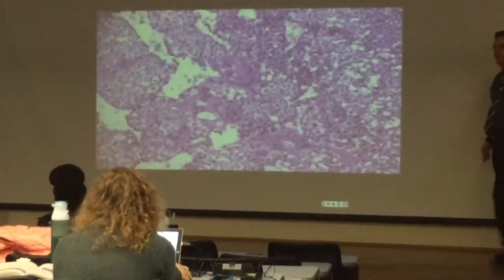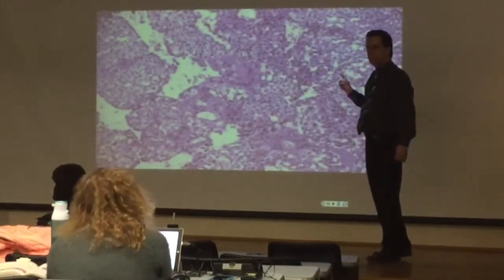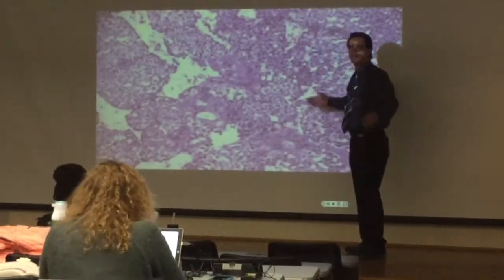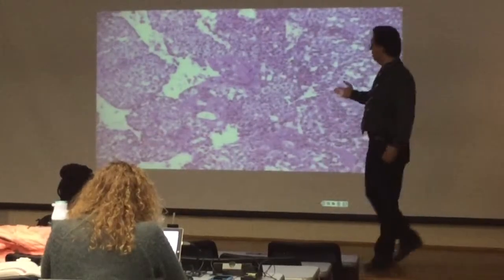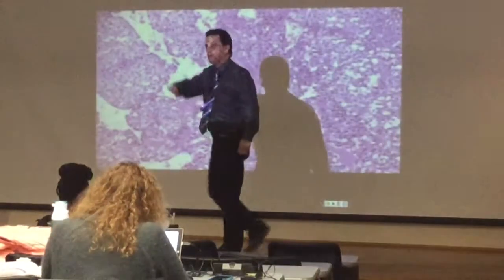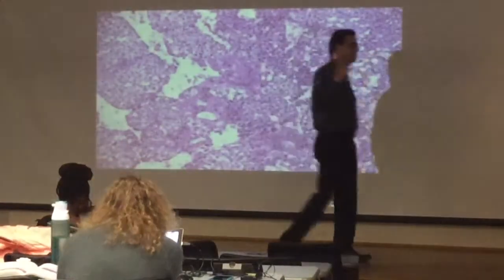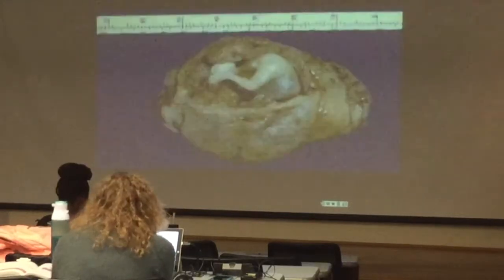This is choriocarcinoma. The difference between choriocarcinoma and molar pregnancy is this: in choriocarcinoma, you should not see any chorionic villi. You just see syncytiotrophoblasts and cytotrophoblasts. This is a malignant tumor of the cytotrophoblast and syncytiotrophoblast. So remember the way choriocarcinoma presents: if beta HCG after the D&C for molar pregnancy doesn't come down or goes up, it's choriocarcinoma. They usually come with hemorrhage in the lung, metastasis in the brain, so it can be hemorrhage in the brain. Done.